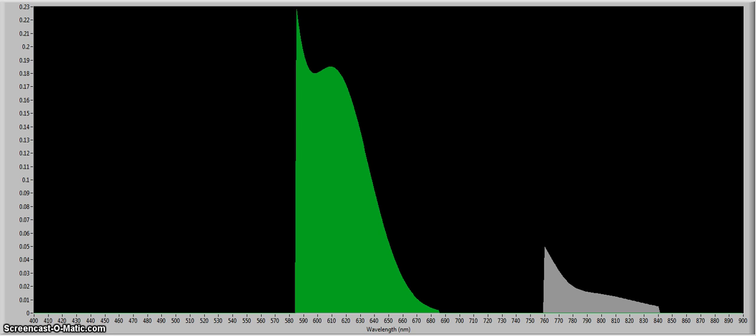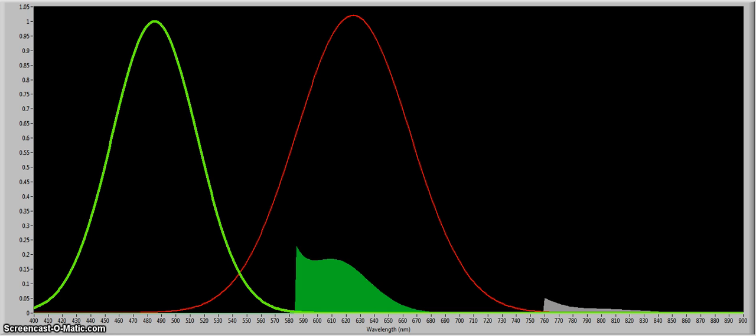Design needed to be changed as a result of this analysis, and what was effectively done was additional red LED illuminators were added to the design to bolster the signal that is seen here to a much larger value to enable effectively almost the same magnitude of signal between the green and the red channels. Another key aspect of this analysis is that it enabled an in-depth look at how manufacturing variabilities also impacted overall system design. What we've got here is basically our centralized green LED along with its associated fluorescence signal, and the centralized red LED with its associated fluorescence signal.